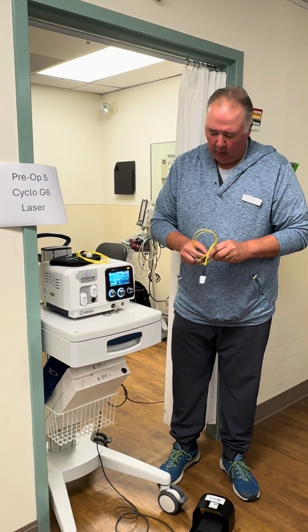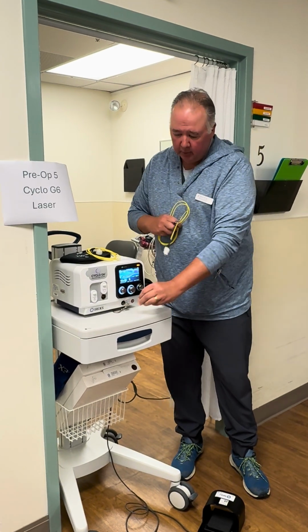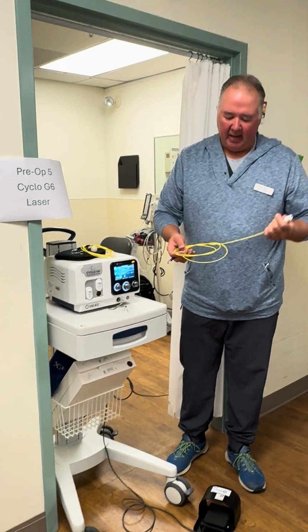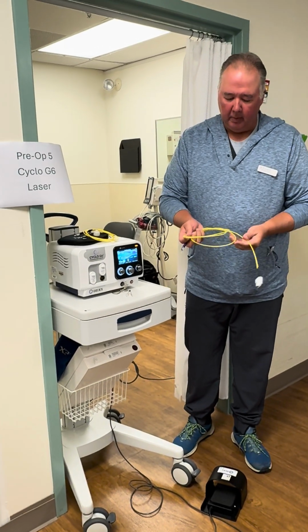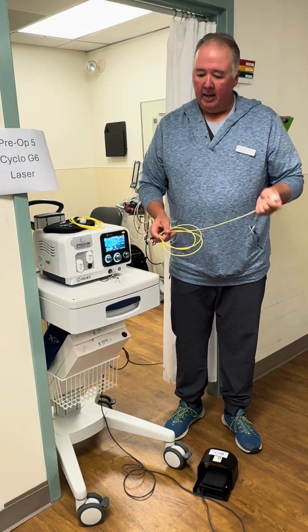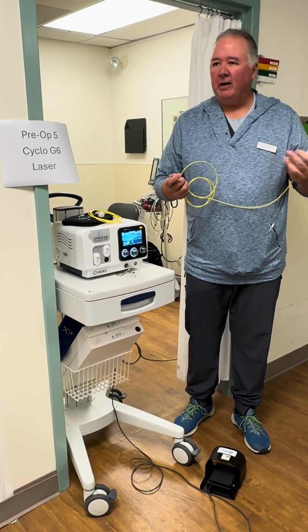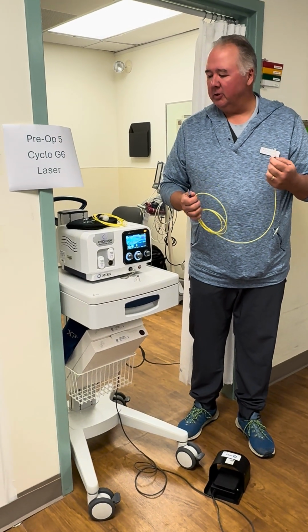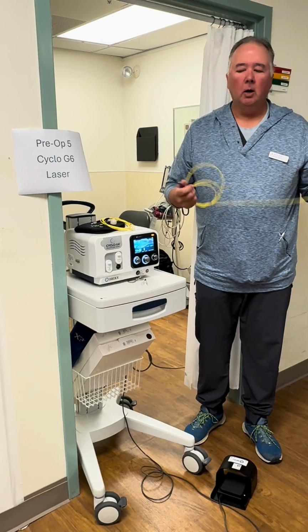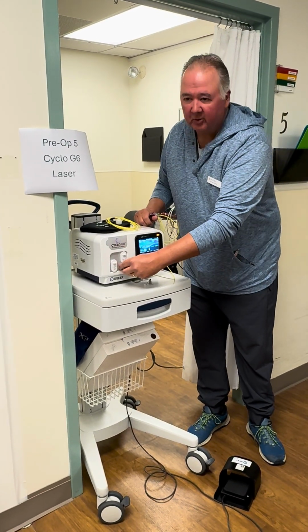One other thing too, with the probes, there's a timer chip inside all these probes, so that should you set it up and walk away from the machine, maybe a case got bumped or something like that, and you come back in and go to use this, it'll time out. It was a fail safe that they built into the system because years ago people tried to use the probes multiple times. So number one, it's against the law, and number two, it's kind of gross.